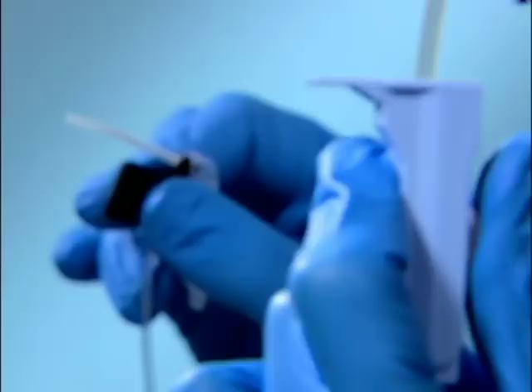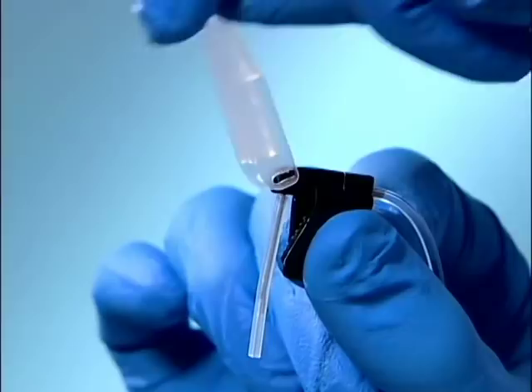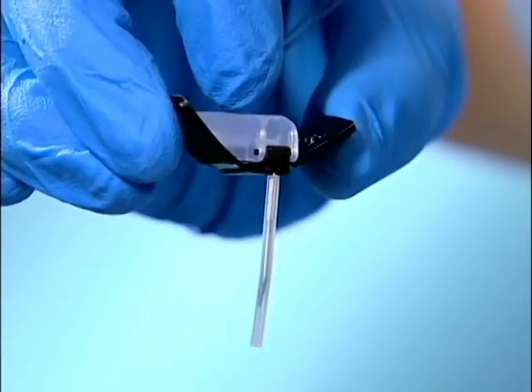To access the port, the needle guard should be placed over the wings. Then use normal technique: grasp flexible wings with thumb and middle finger. Remove the protective sheath on the needle.